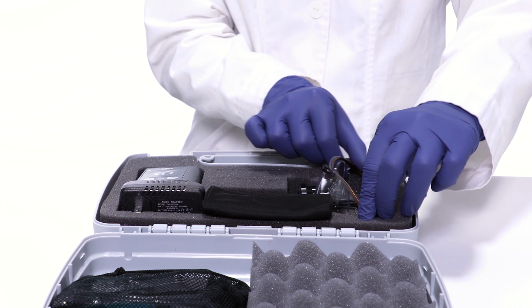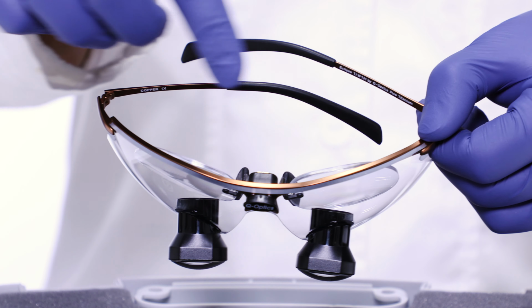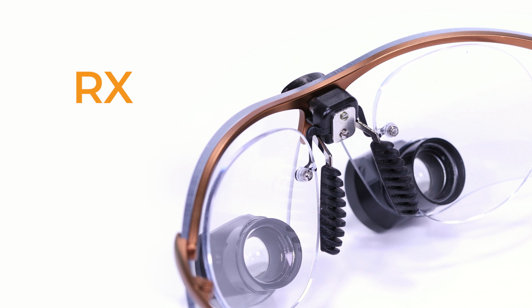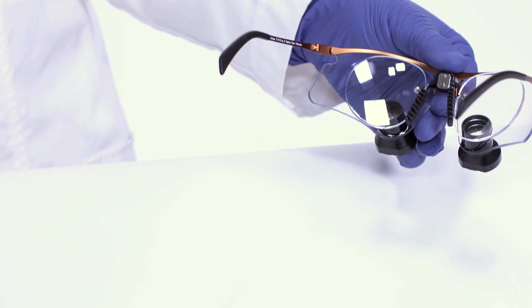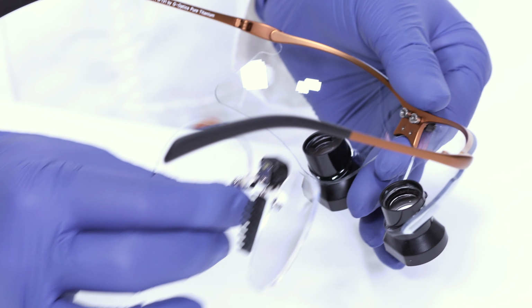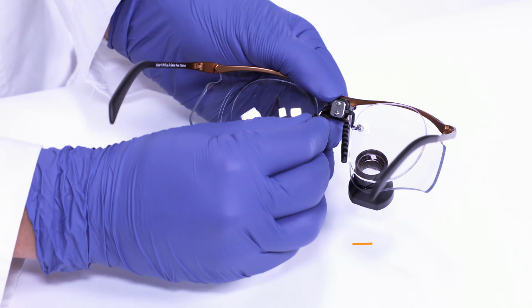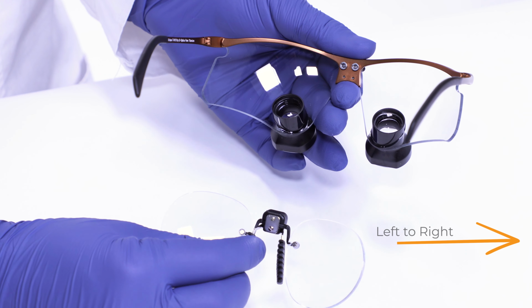If you're using a prescription insert with an Eclipse frame, the insert will be attached to the back of the frame when shipped to you. Hold the frame with the telescopes pointing away from you and pinch the bridge of the frame. Apply gentle pressure with your thumb to carefully slide the insert out from left to right until it fully clears the shoulder screws. This can be a tight fit. Place only enough pressure to coax the insert into moving.